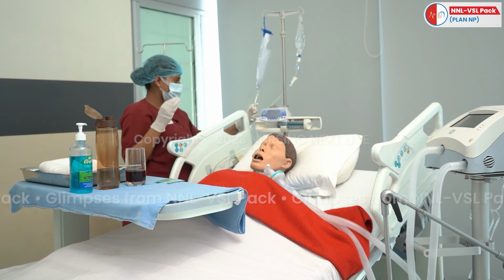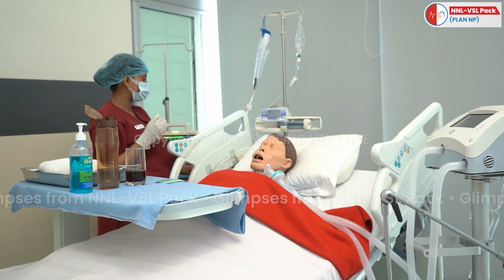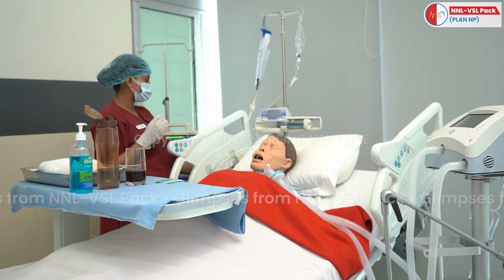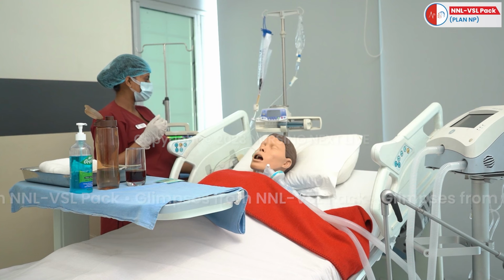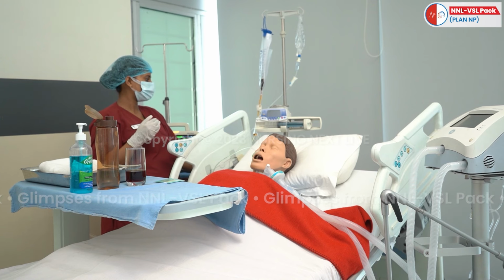Set the bag with the estimated drip rate of the feed as per the doctor's order. Amount of fluid into drop factor upon time in minutes. Drop factor of the gravity bag is 20 drops per ml.